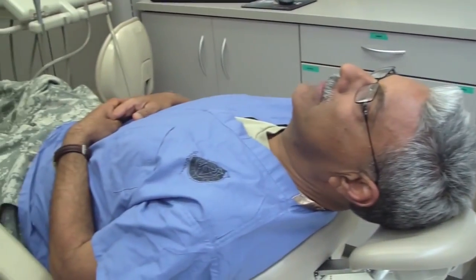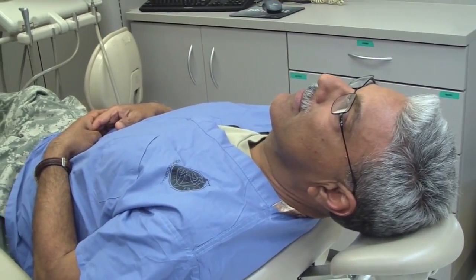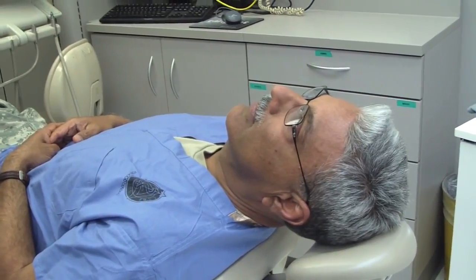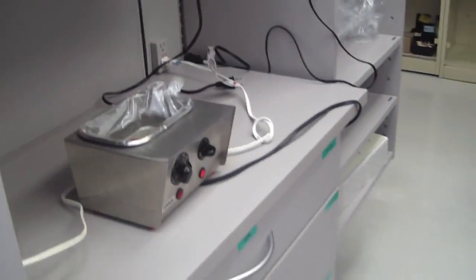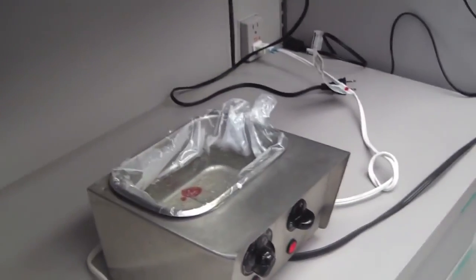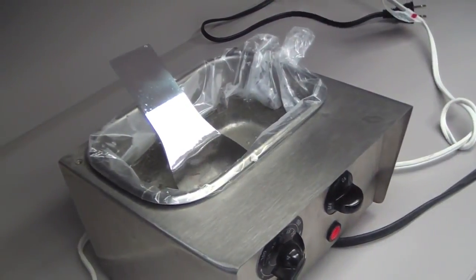Now we're going to switch to the chair. Okay, so here we are. Typically, you can have your patient seated any way you'd like. I find that having the patient supine simplifies the photographic procedure. And another little tip that I've learned is using a water bath to place your mirrors in. So that will warm them up. And if you don't have a dental assistant or you've tasked them to do other things, this actually keeps the mirror warm.